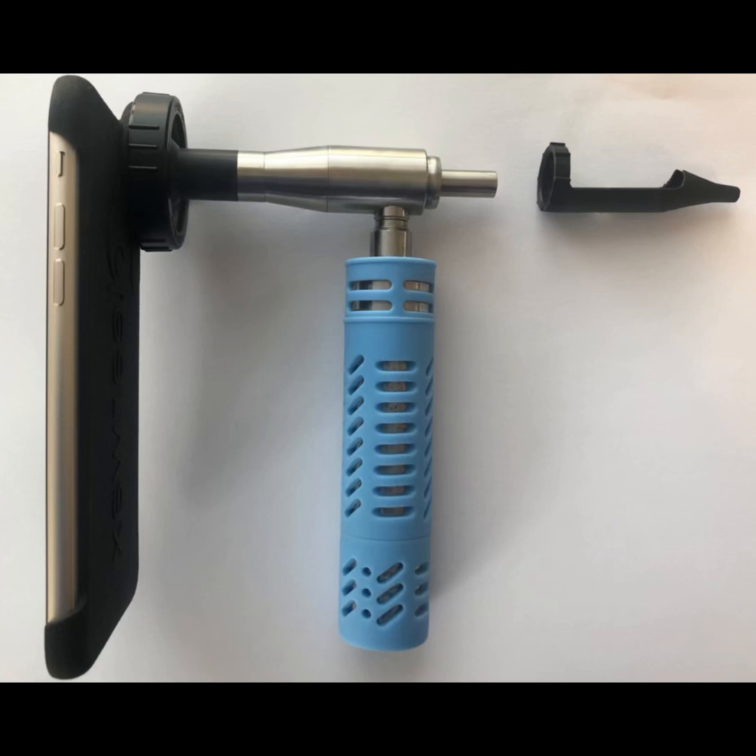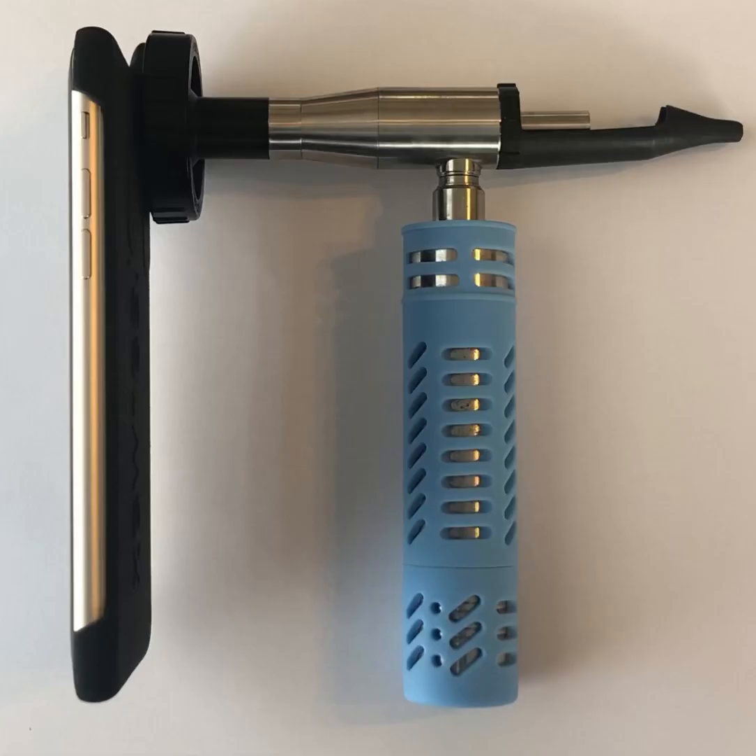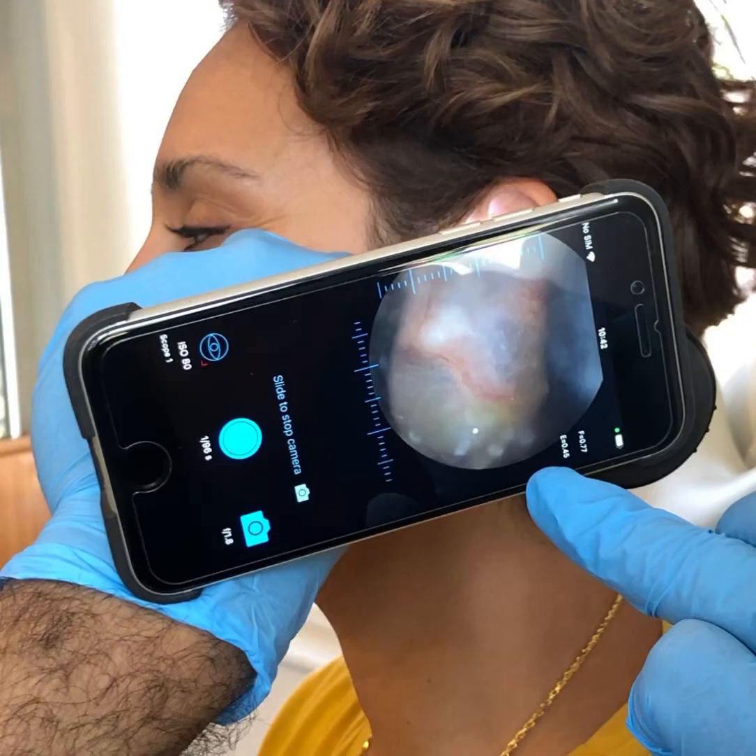This is the design of the Waxscope. You've got the light source that's attached to the main Waxscope itself. Then on the right-hand side, the speculum, which attaches and affixes itself. You clip it onto the Waxscope, and then we've got the iPhone SE on the left and the iPhone SE adapter that connects the whole system together.